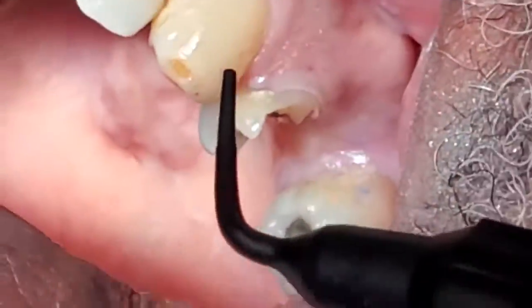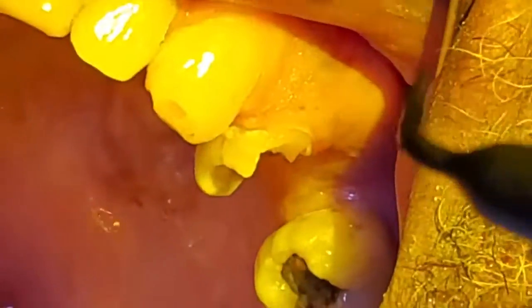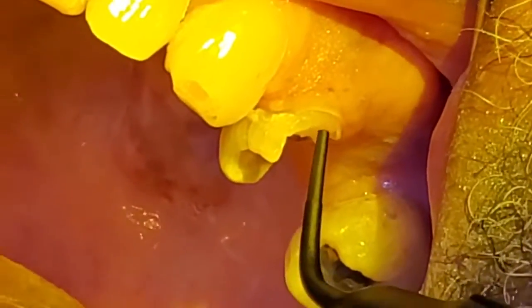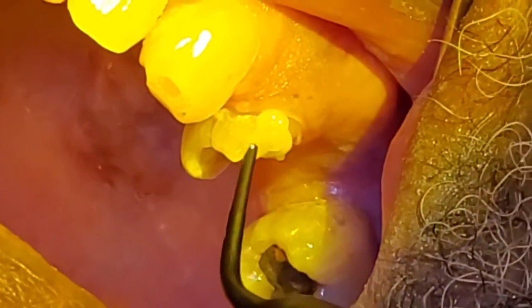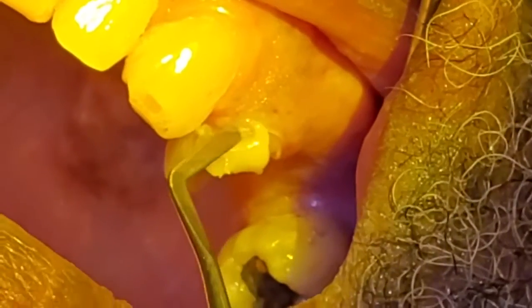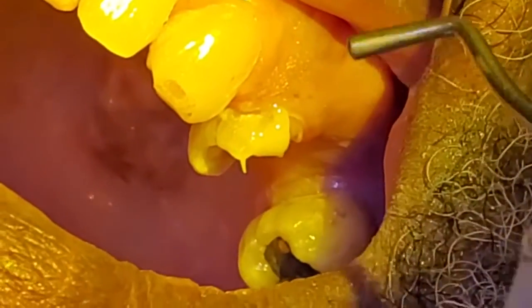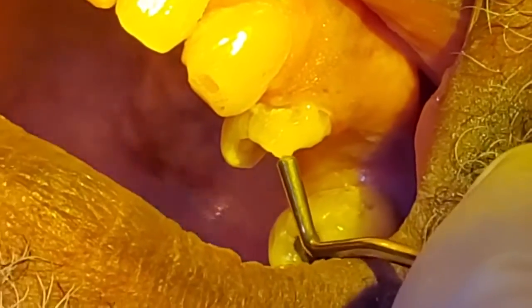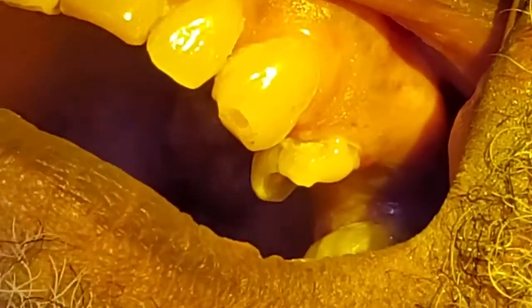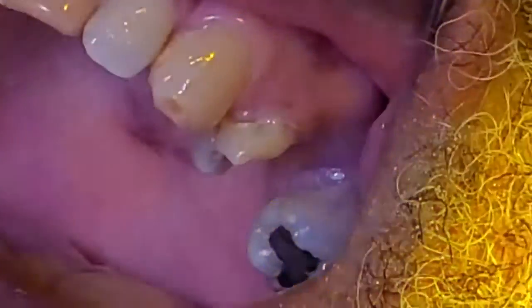Now we're going to use the EverX Flow. I'm going to intentionally move my overhead light slightly and put a filter here, but I want you to see how this flows on the outside. It kind of flows like vaseline, but it's a moldable flowable material that I can literally massage and mold onto the side of the tooth. I can manipulate it, I can place it — notice how I just maneuvered that into place. I'm going to go ahead and light cure that, and then in a couple of increments I'm going to fill our entire tooth.